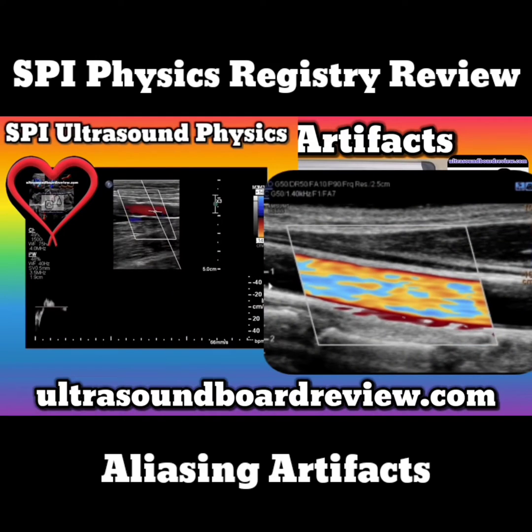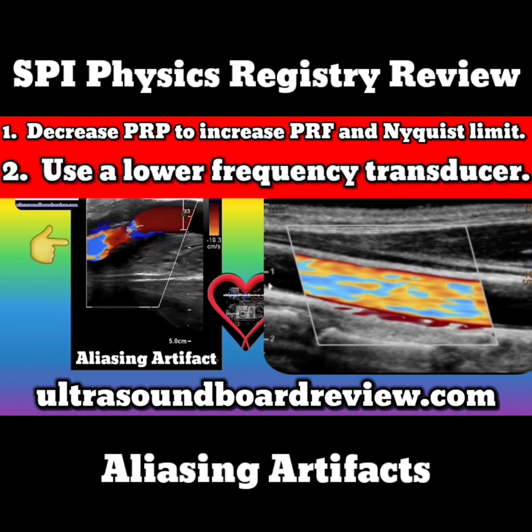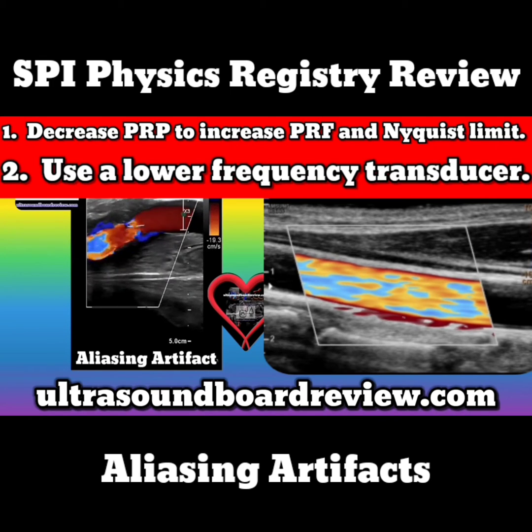The best ways of eliminating aliasing include decreasing the pulse repetition period, or PRP, to increase the pulse repetition frequency, or PRF, and the Nyquist limit. Apply a low-frequency transducer to create a small Doppler shift for blood flow velocity.